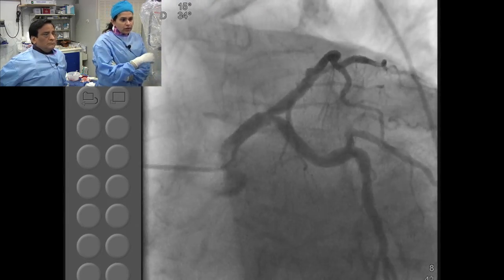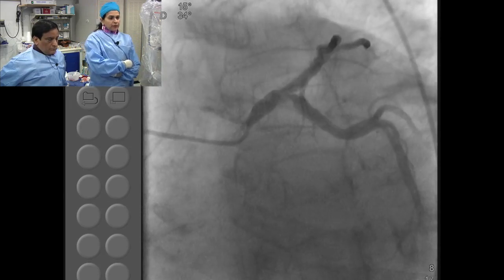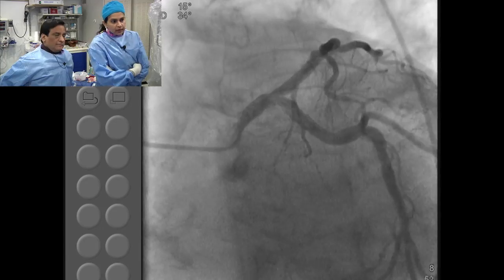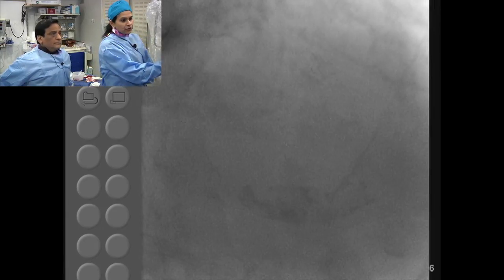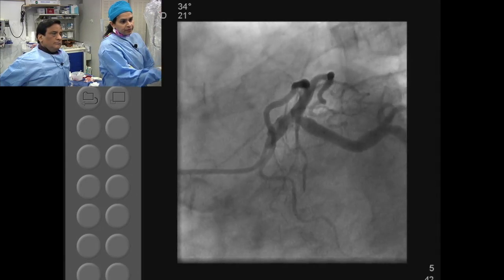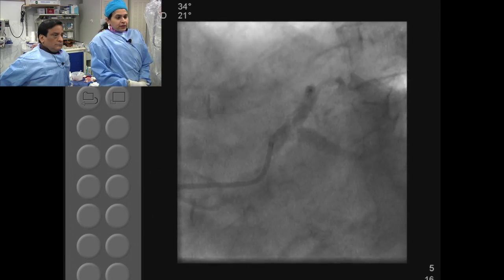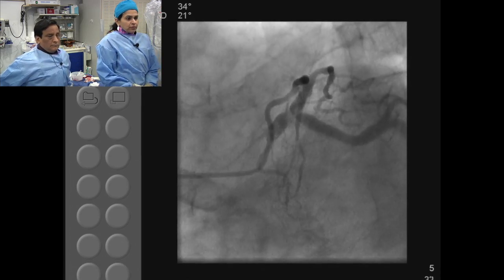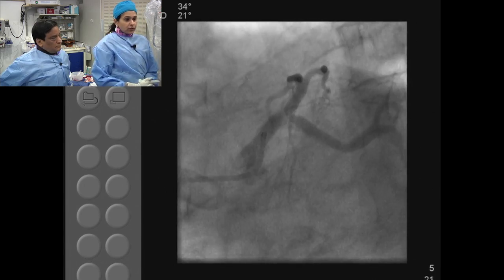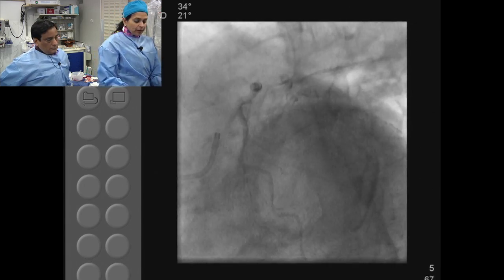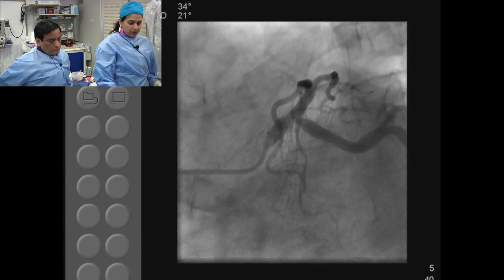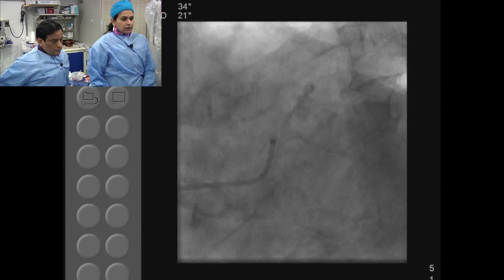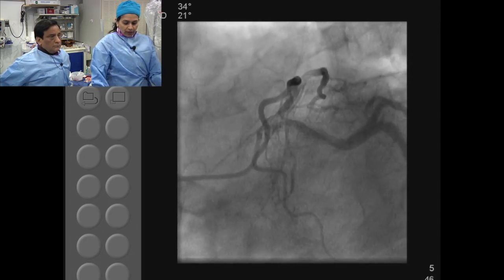Essentially we are talking about a calcific distal bifurcating left main. The biggest concern here would be the ostium of the circumflex. Based on the amount of calcium, we definitely want to do atherectomy. The question is how do we approach this — do we use imaging modality just to see the amount of calcium and then pick the atherectomy of choice? We have to do atherectomy of both vessels, and how we are going to do it is what we are going to show.